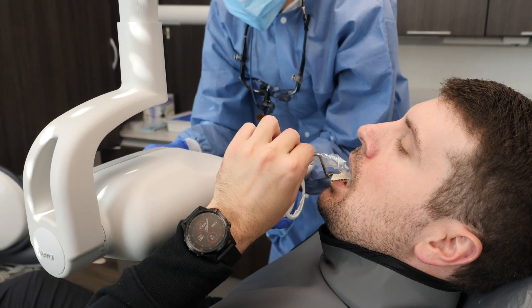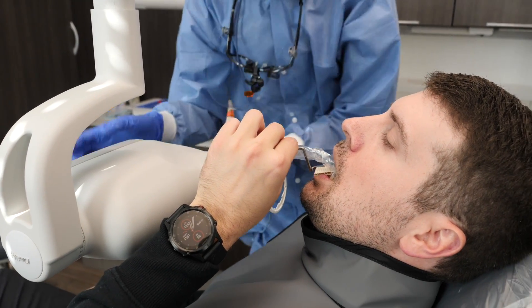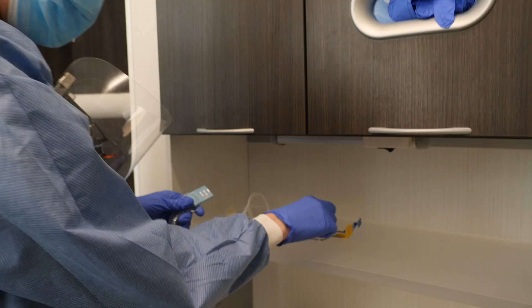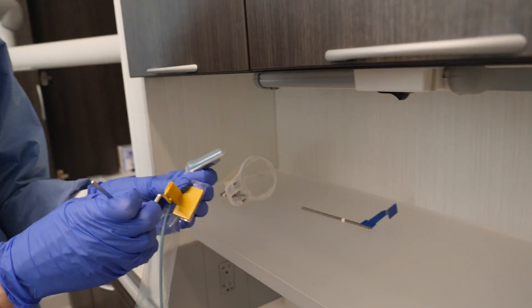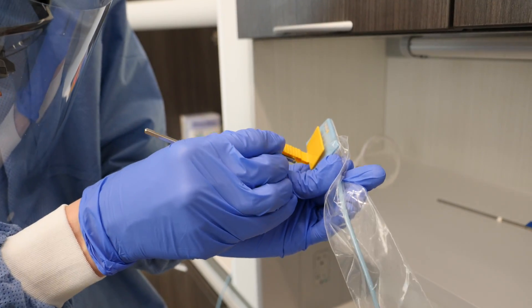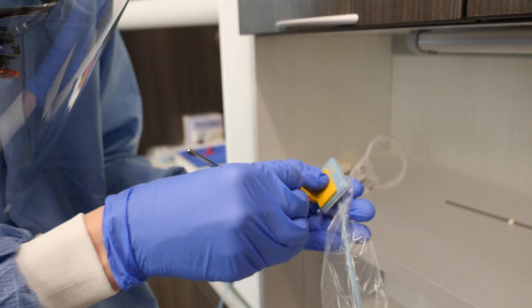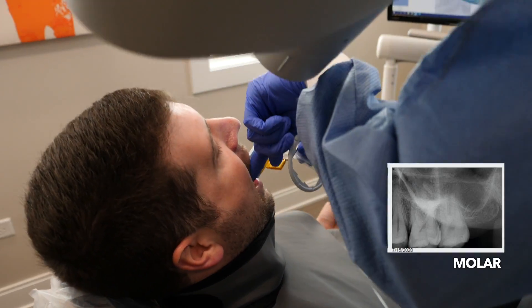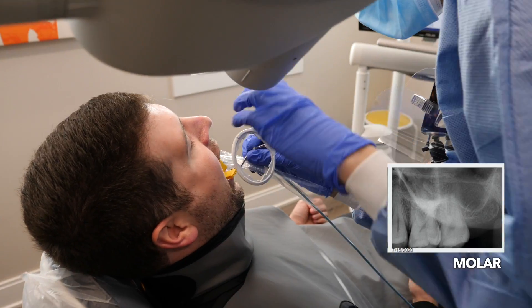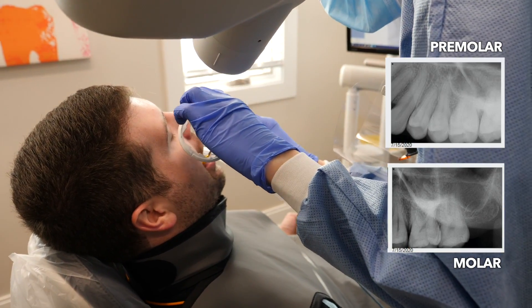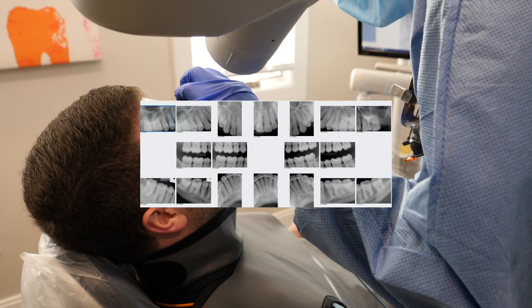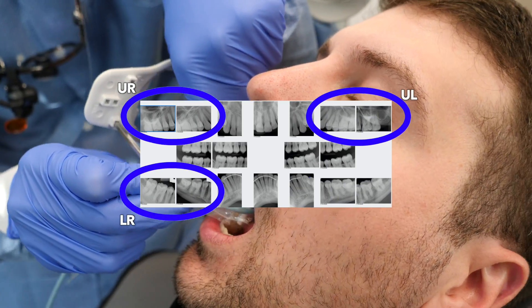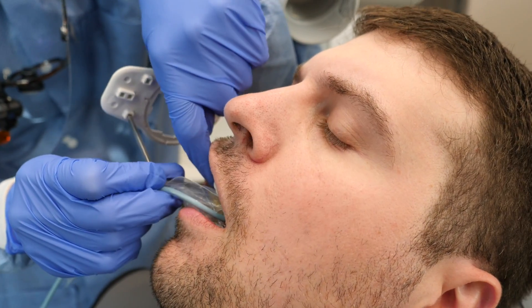Now that we're finishing up with the anterior teeth, we've moved on to the posterior, or back, teeth. Here we take two images in each quadrant — one for the molars and one for the premolars. You have four quadrants in your mouth: upper right, upper left, lower right, and lower left, and that's what we're doing now.